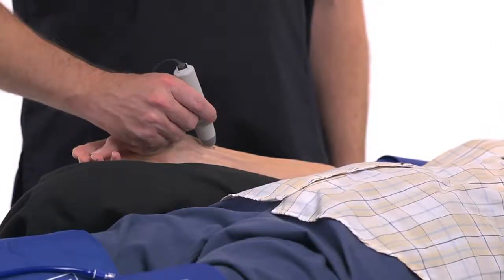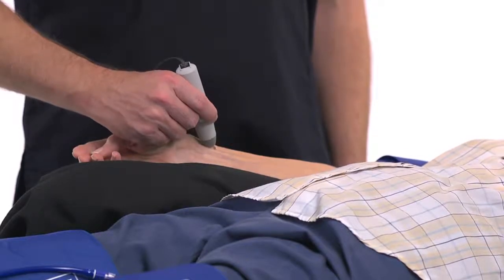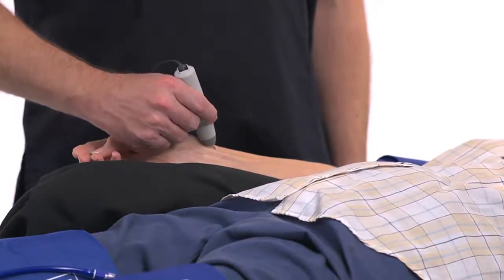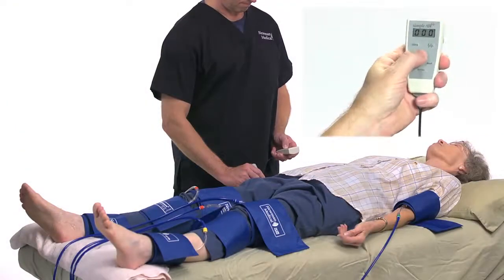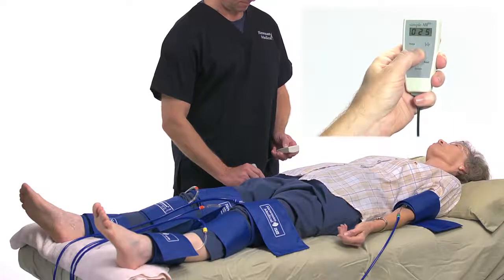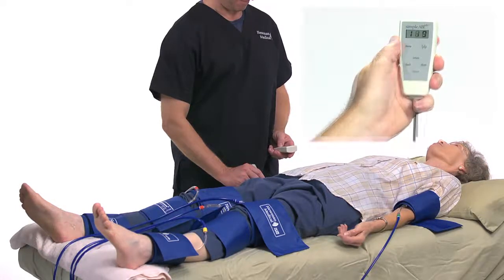Place the Doppler probe at an angle to the skin over the radial artery. Move the probe slowly back and forth until the strongest arterial signal is heard. Press and hold Inflate on the cufflink remote and inflate the cuff until you no longer hear the signal and continue for an additional 20 mm. Release the Inflate button and the cuff will automatically start to slowly deflate.